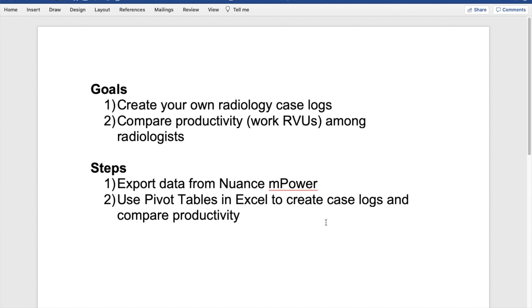My name is Chris Nguyen. I'm one of the Neuroradiology Fellows at USC, and in this video, I'm going to show you how to create your own radiology case logs and how to compare productivity or work RVUs among different radiologists.